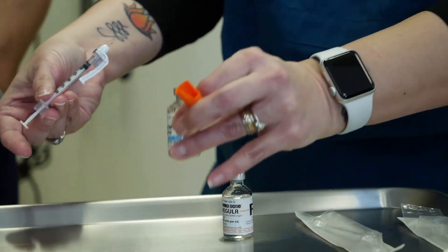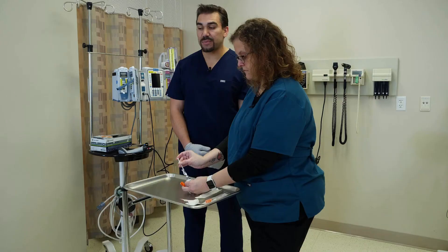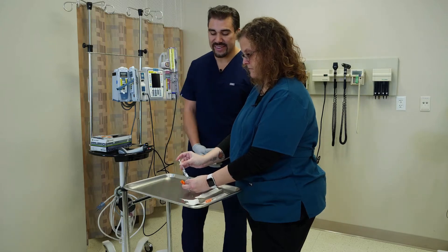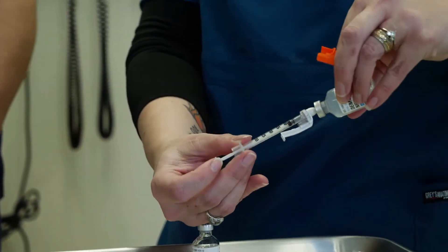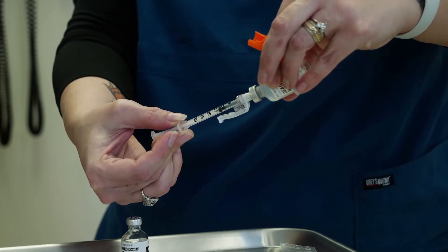Next we are going to withdraw from the cloudy. Make sure you don't push the fluid into the cloudy — we're only drawing from the cloudy, and we're just going to the desired order.